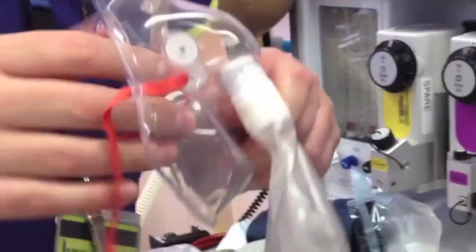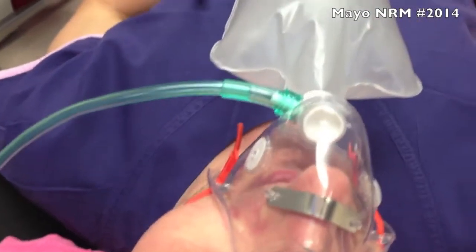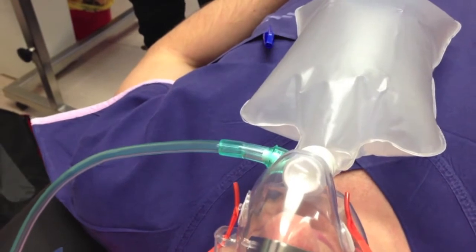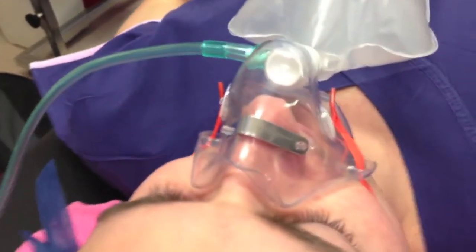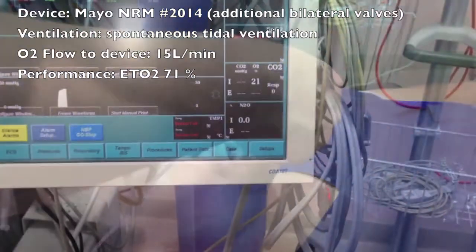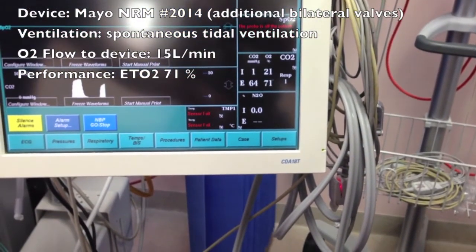The Mayo non-rebreather mask model number 2014 has bilateral valves on the ventilation ports in addition to the valve between the mask and the reservoir bag. During inspiration, these valves are intended to limit entrainment of room air through the ventilation ports. Although visible movement of the valves is not evident during normal tidal respiration, this slightly further raises the end-tidal oxygen achieved after 3 minutes of breathing to 71%.